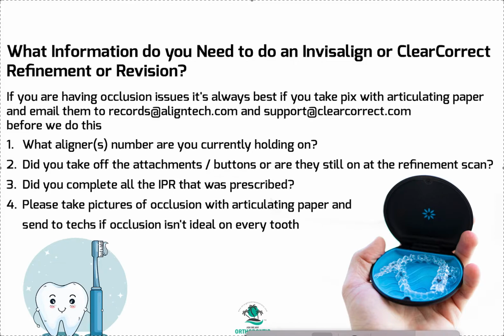It's totally fine, and we have specific videos answering this question, but in a nutshell, it's totally fine to leave them on if it's something super minor, but if it like crazy didn't track, it's better to take them off and we'll just completely redo them. So if you leave them on, they might give you new ones to put on other teeth, or they might swap some out. But if you really can't, let's say you're actually mailing the aligners to somebody, they're off at college, you need to be specific and say no new attachments, okay? So this is information we need to know.